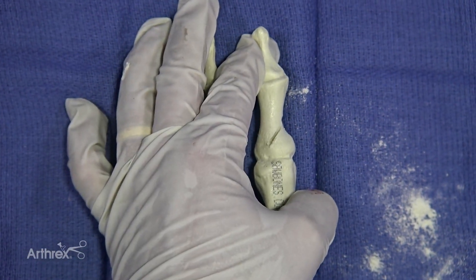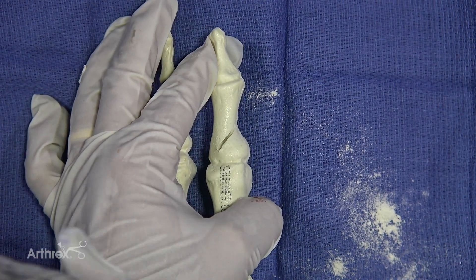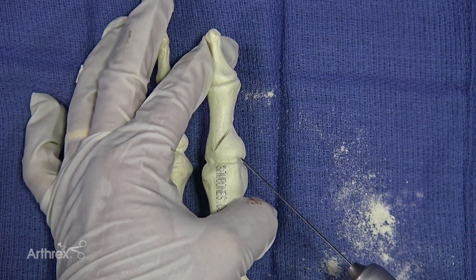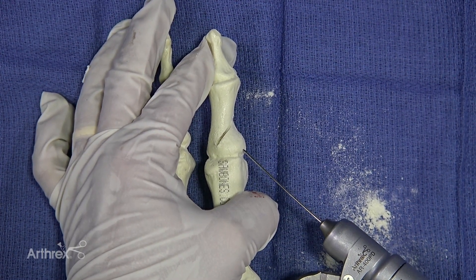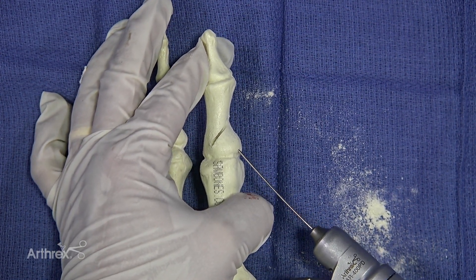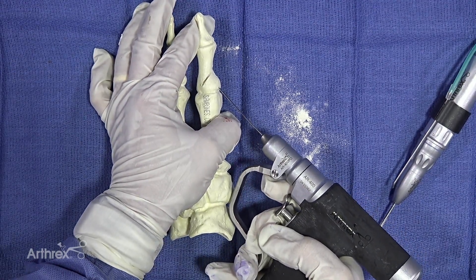As you close it down, you get a guide wire for your compression screw, and your starting point for the compression screw is going to be right at the base after you've made a tiny little incision. You're basically going to shoot straight across there like so.